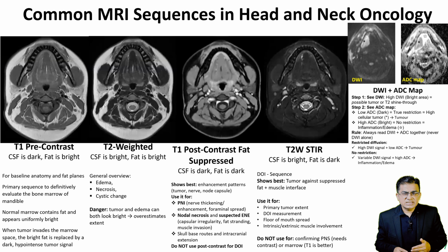As an oncology resident, you do not have to read these scans like a radiologist, but you absolutely must know what each sequence is built to do. This way you will be able to evaluate MRI independently to some extent. You will be able to take some decisions based on your reading of the MRI of your patient. If you look at the wrong sequence for the wrong anatomical problem, you will stage the patient incorrectly.